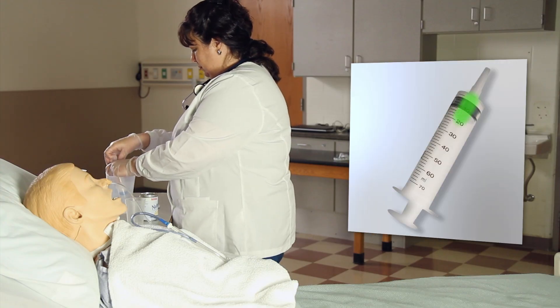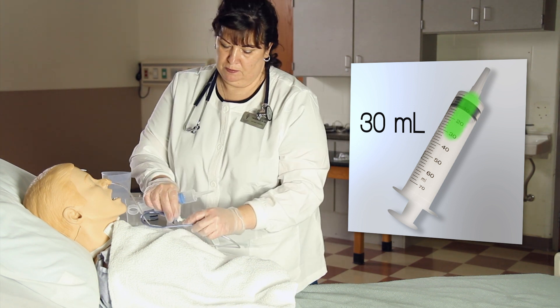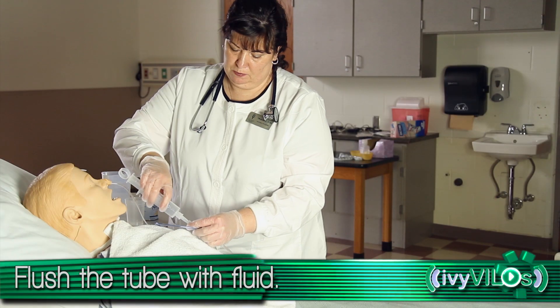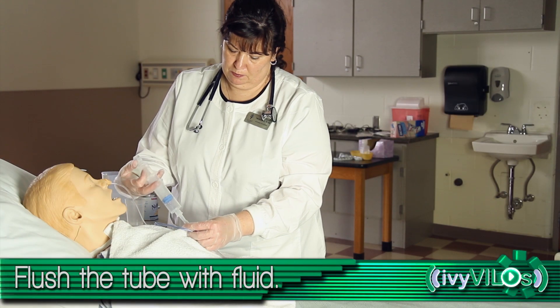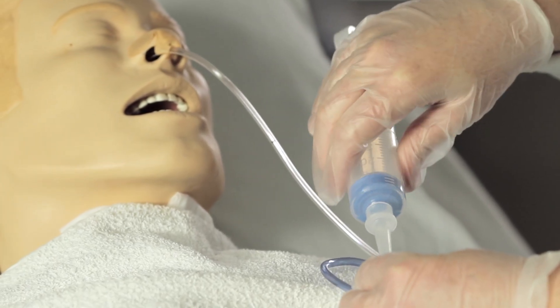Draw up 30 milliliters of irrigation fluid. Flush the tube. Detach the syringe.